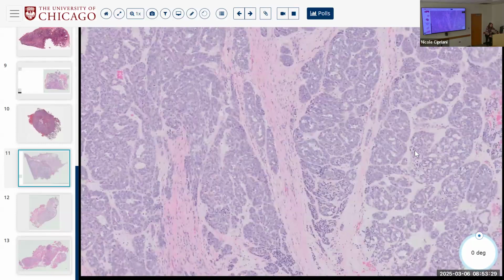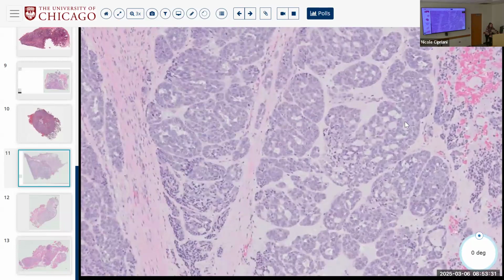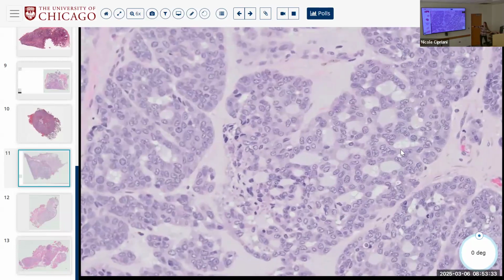So you have these nested, tubular, even cribriform patterns, right? Cribriform isn't pathognomonic of adenoid cystic, but it is a morphology that you can see in many tumors. You kind of have to have the conglomerate of circumstances to call something adenoid cystic. In this case, how are the nuclei different from what we saw in adenoid cystic, which is often on the differential?